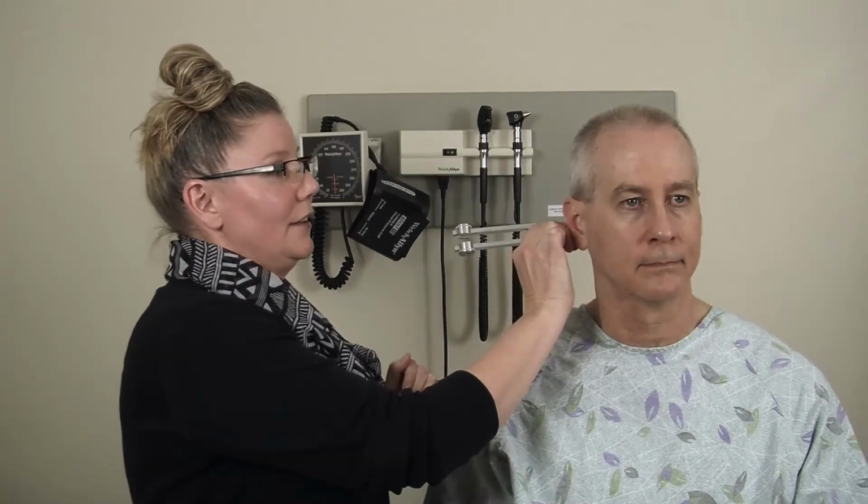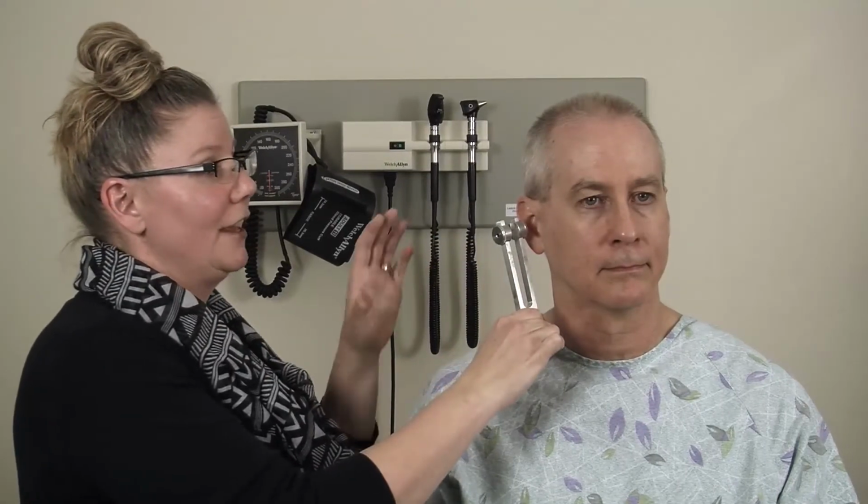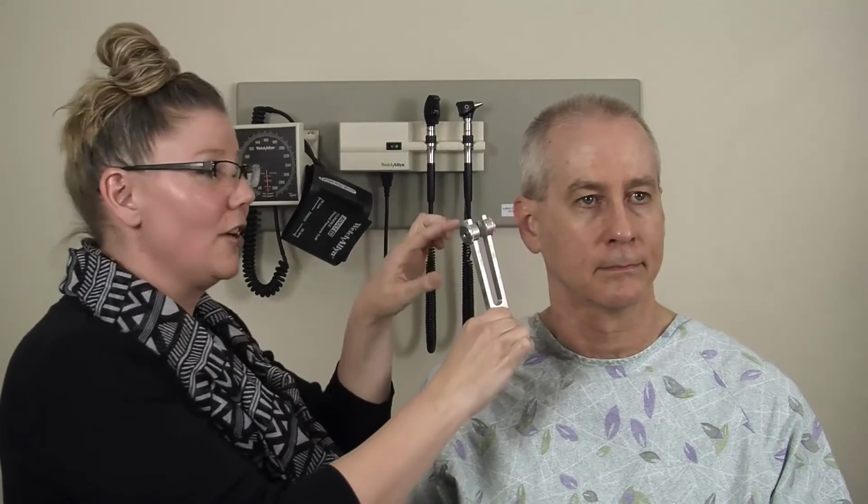Now with a sensorineural loss, often what you get with the Rinne test is they will be able to hear it on the bone until they stop hearing it. You place it in front of the ear, they can still hear it, so air conduction is greater than bone conduction, but not as much as they would hear in the unaffected ear. So that's the Weber and Rinne test, which is advanced testing for the ear. This is what you would do if you elicit a hearing loss.